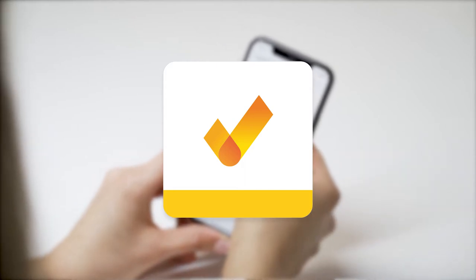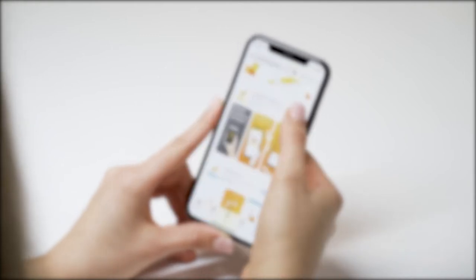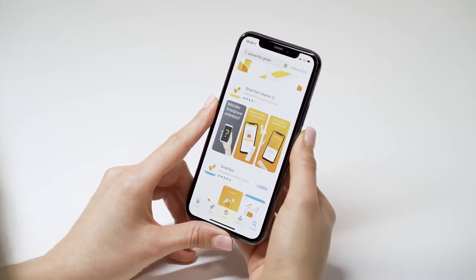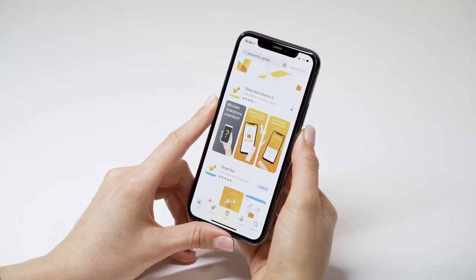Attention! There are two apps: one for professional users only and one for non-professionals. Please download SmartTest vitamin D only. The app does not collect any personal data. Your vitamin D values are stored exclusively on your smartphone.